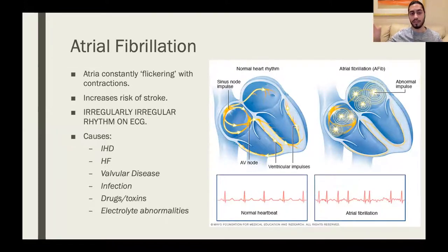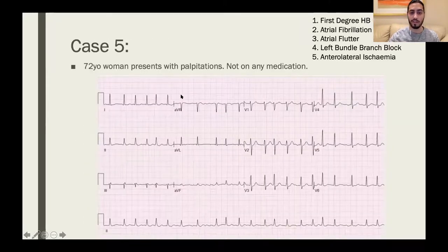Or you can have permanent AF. Some people you'll see in hospital just have normal AF at a rate of between 60 to 100, not tachycardic. They just live their normal life. The only thing you need for that is anticoagulation, and then you just monitor the patient. What we want from this session is to see if we can recognize what AF looks like. And the way you see it is no P waves and an irregular rhythm.